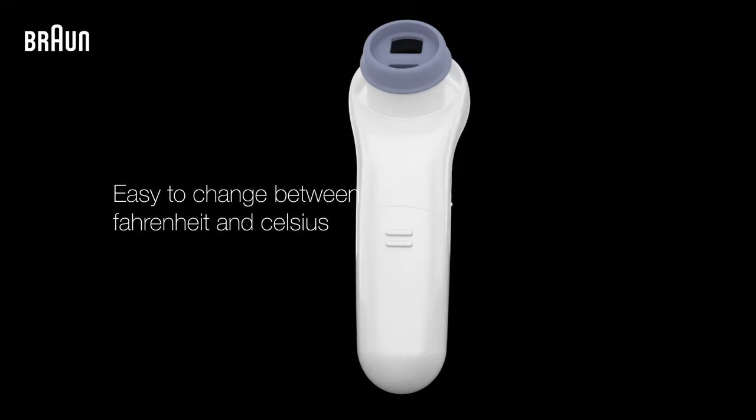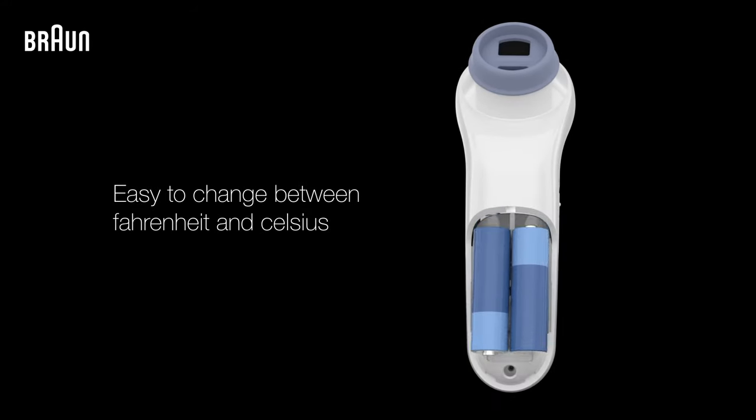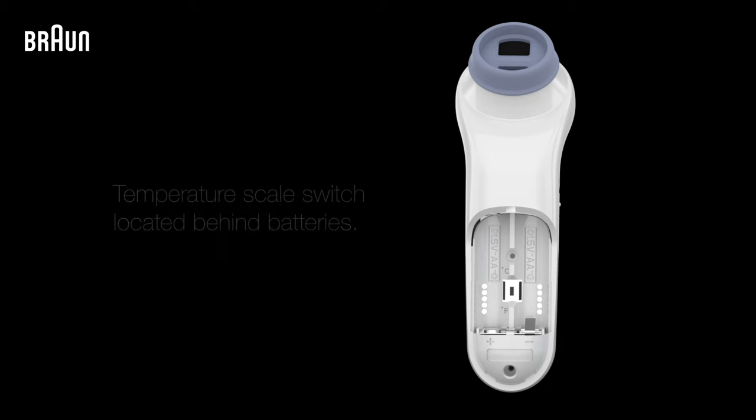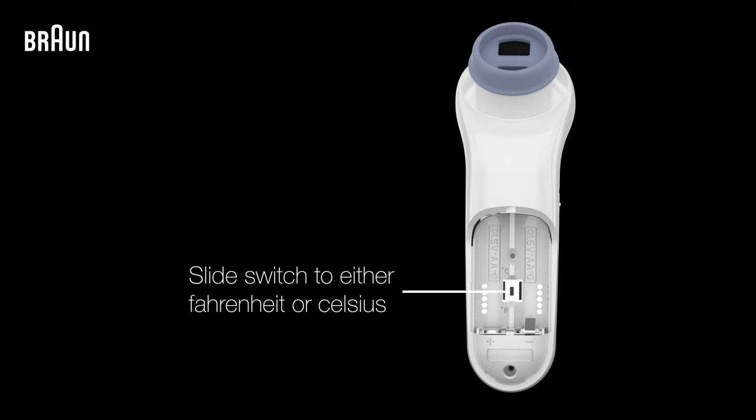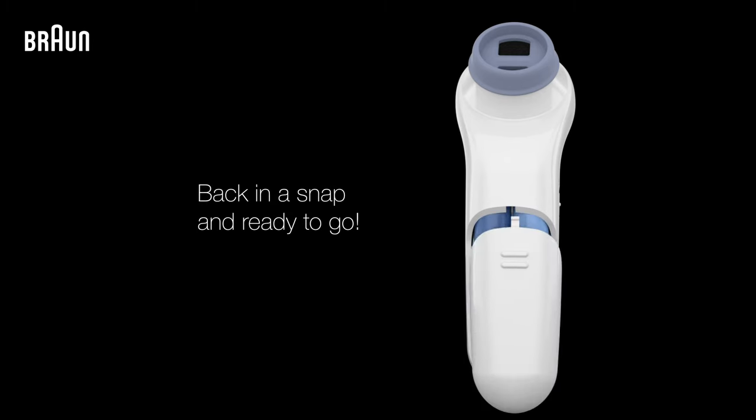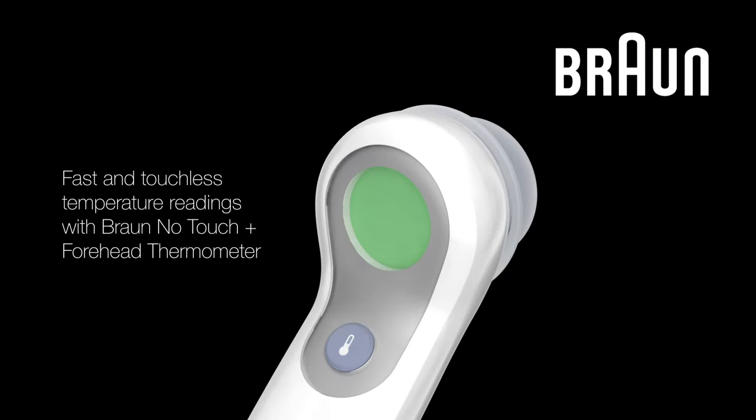To change the temperature scale of your thermometer between Fahrenheit and Celsius, open the battery compartment and remove the batteries. Slide the temperature scale switch to your preferred temperature scale. Replace the batteries, close the compartment, and your thermometer is ready to go.